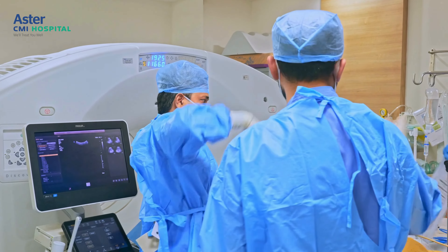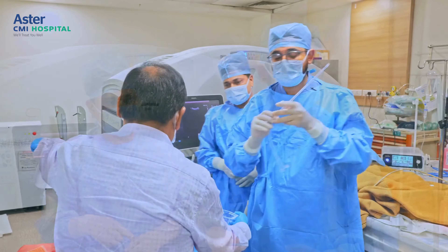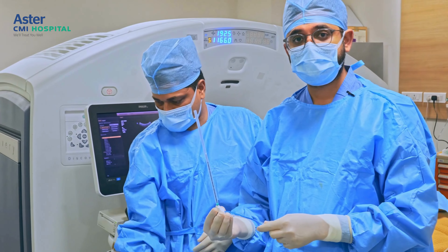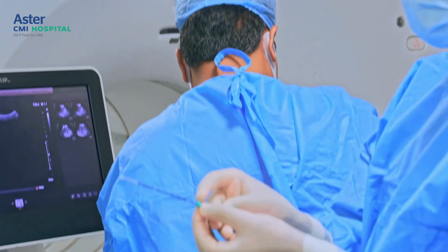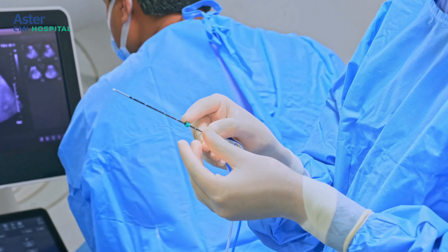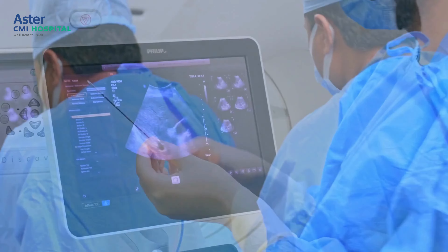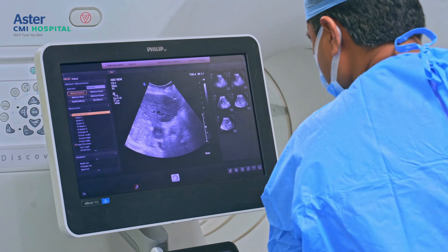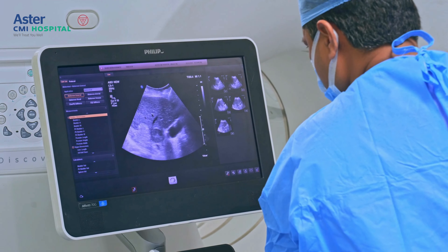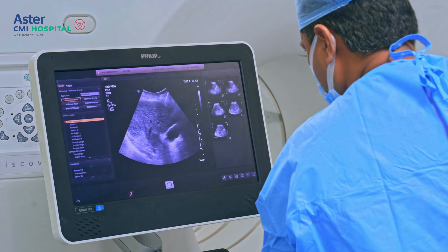Ideally, the entire length of the needle should be seen, which means we are in-plane with the probe. Once the local anesthesia is given, we let it act for about 30 seconds to 1 minute. By then it gives us time to get the microwave antenna ready. That is the microwave needle along with the tubings and connections. There is a stopper that helps us measure the length of the needle going inside — in this case about 9.5 cm. We need to advance the needle 9.5 cm inside, placing it in the center of the lesion.